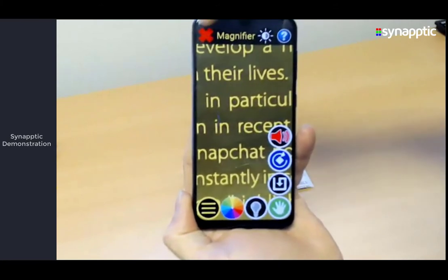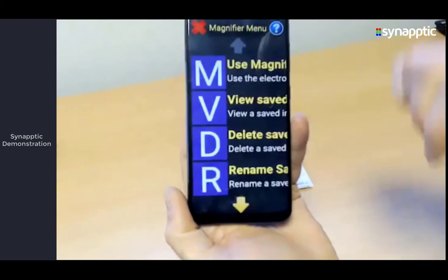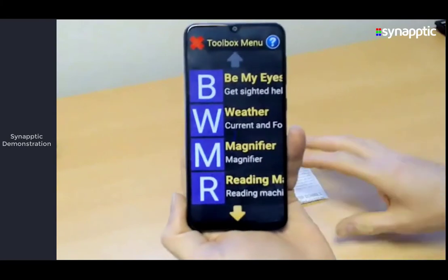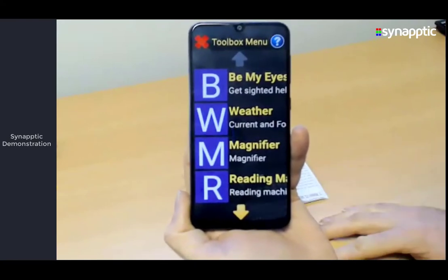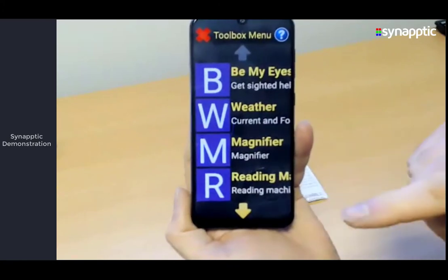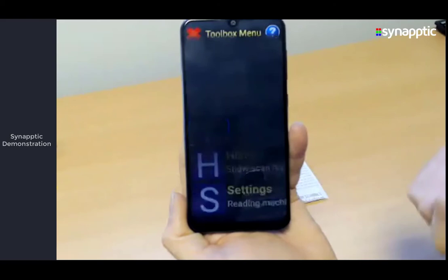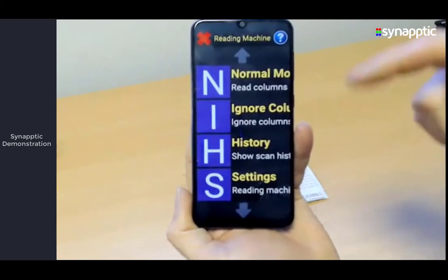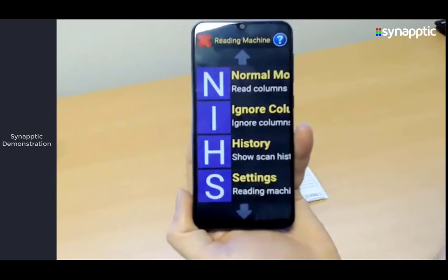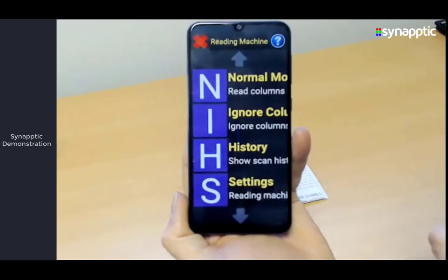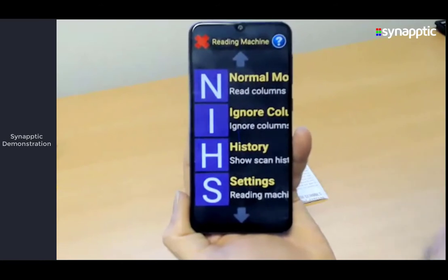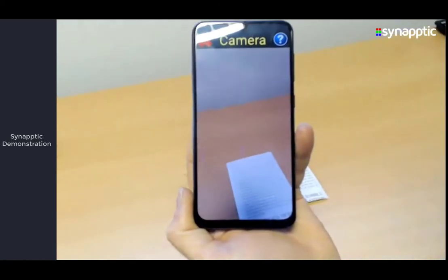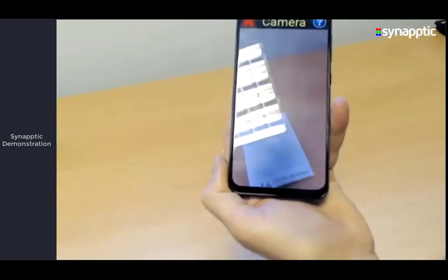The magnifier is good for little bits of text. If you have a whole letter or bank statement you want read out, you're much better off using the separate reading machine. The reading machine has two main options: normal mode reads text up and down columns as you'd expect, while ignore columns mode is designed for things like bank statements where you want it to read across all the time. You hold the phone or tablet over the text, then touch the screen to take a photo of the text.